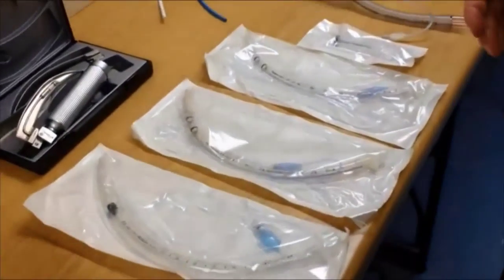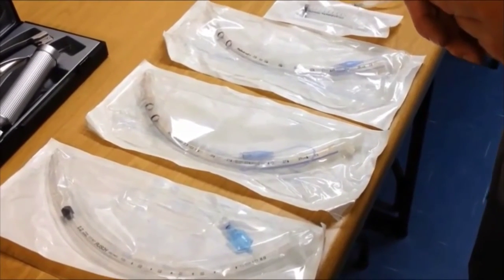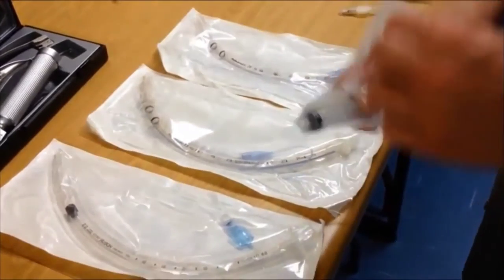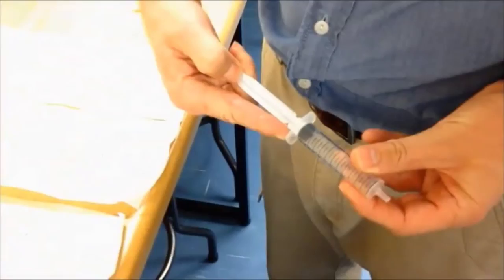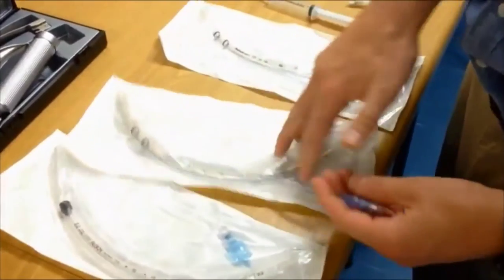The endotracheal tube should be checked for a functioning bulb without compromising the sterility of the ET tube. We suggest the following: open the syringe you are going to use and then open just a corner of the endotracheal tube you are going to use and retrieve the pilot cuff.